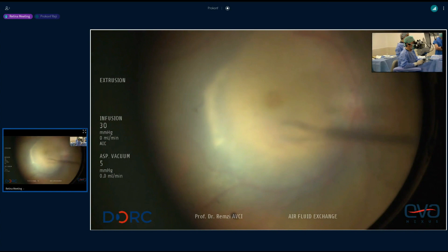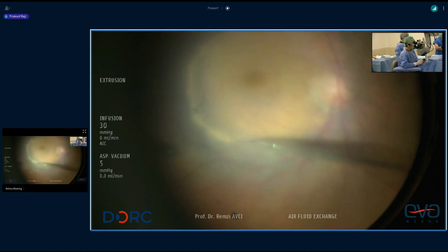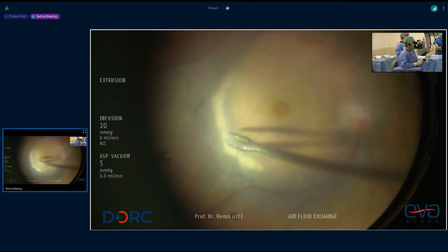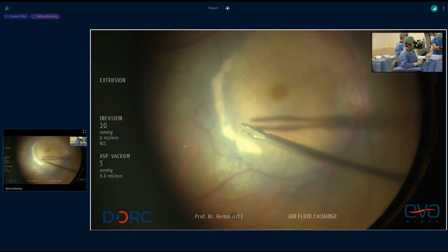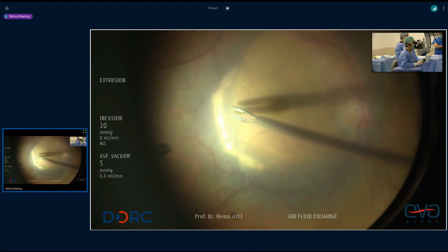We already finished the crescent area. Now I will lift the ILM from the surface of the retina, but we need some more. It's interesting how people create flaps like this — you're creating a large temporal opening to maximize the flap size. The only disadvantage is that you're having to do a lot of pickups in the temporal area, where the nerve fiber layer is thinnest. But it's certainly creating a very large hinged flap.